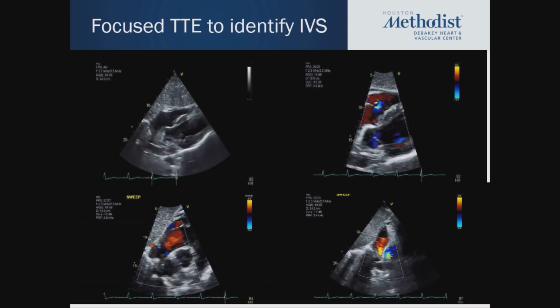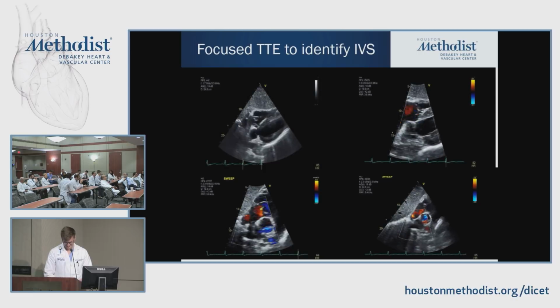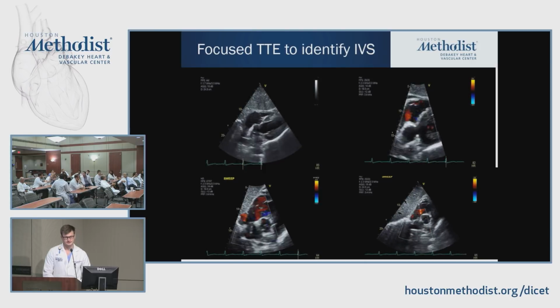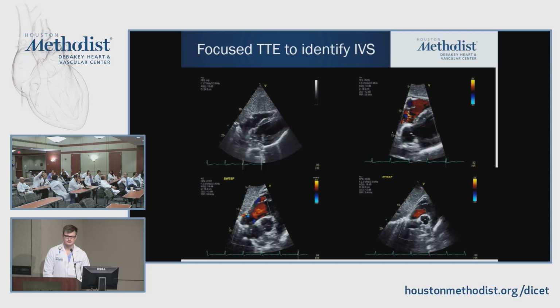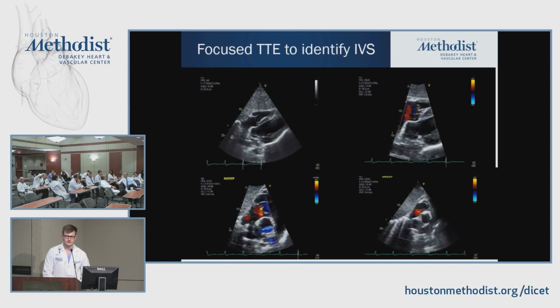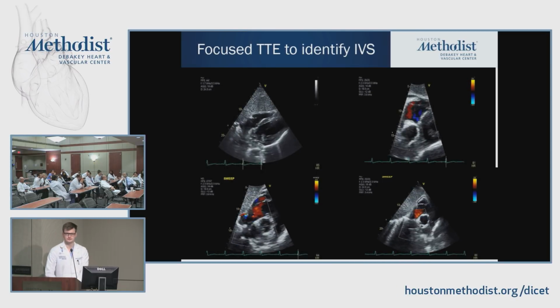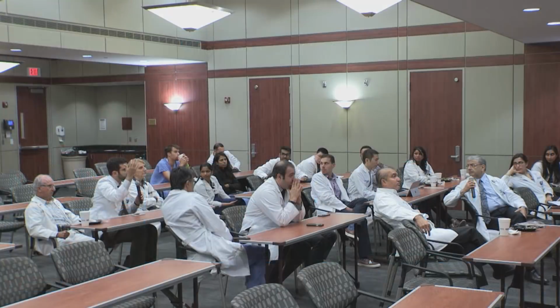My two arguments against the CT diagnosis: if the membranous septum is very aneurysmal, how do you know that what you're seeing is not the membranous septum just bulging, an aneurysmal septum rather than an actual perforation? And the second thing is, if the LV pressure is 100 and the RV pressure is 40 tops, it's going to alias by color Doppler.